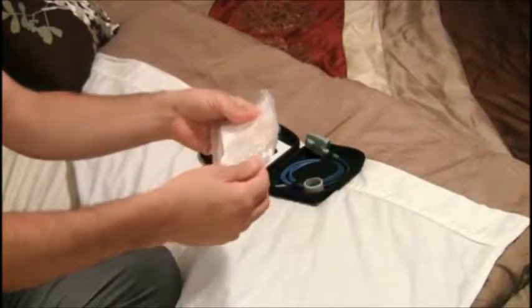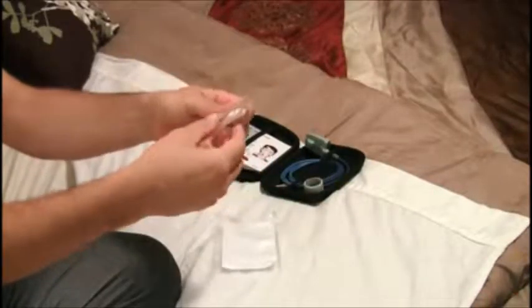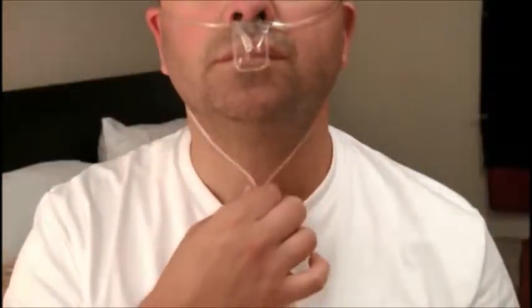First, remove the nasal cannula from the pouch. Take the nose end of the tubing and position the nasal prongs into each nostril. Then wrap the tubes back and over each ear and adjust the slider beneath your chin.